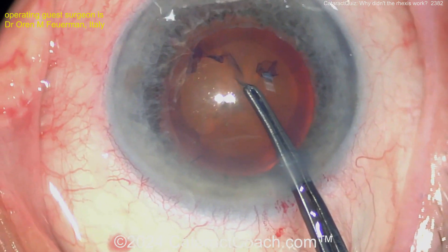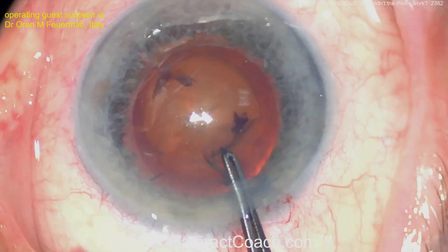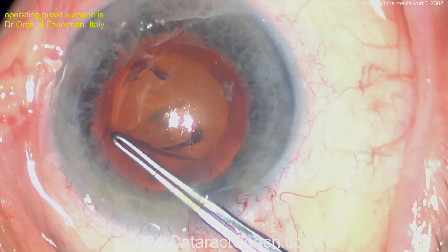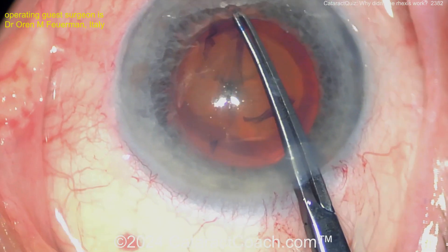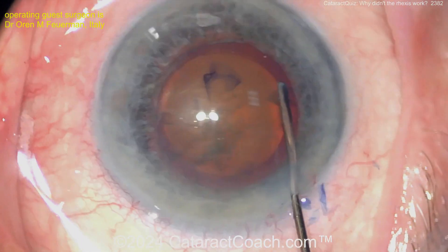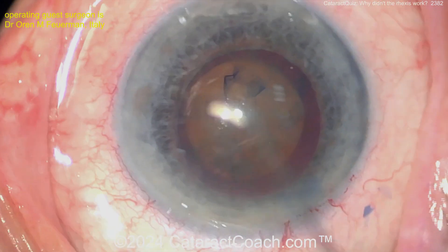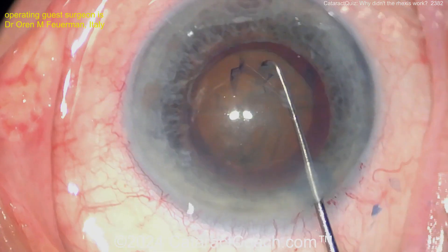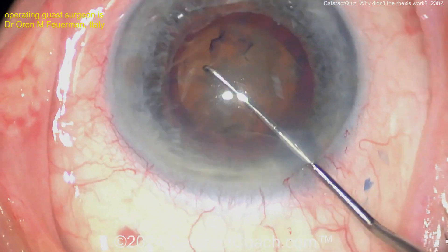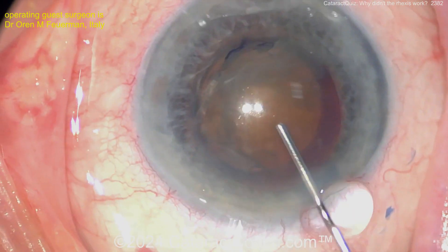Something very interesting — this is an unusual case. It looks like there are basically two anterior capsules — the anterior capsule is split. The anterior capsule is typically noted to be about 14 microns thick. In this situation, maybe it's split, maybe it's a developmental thing, maybe it is true exfoliation — not sure exactly.